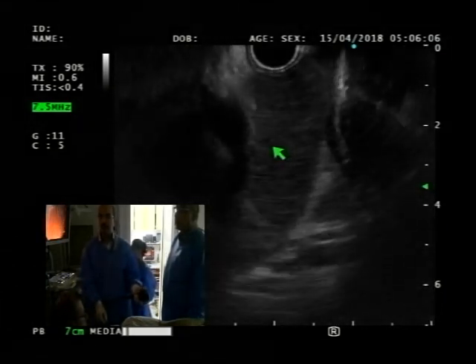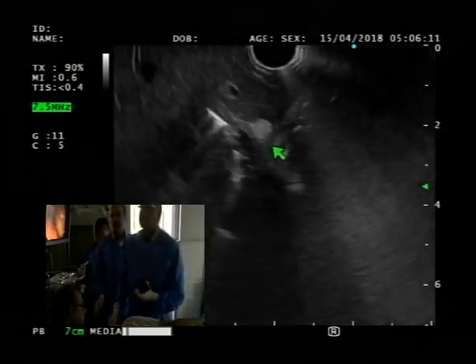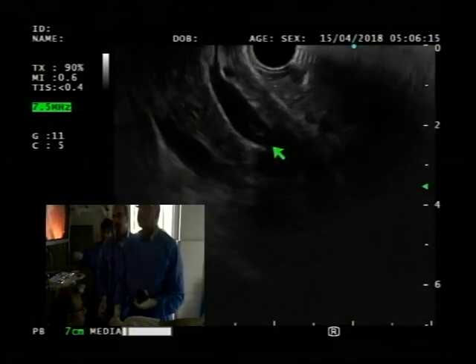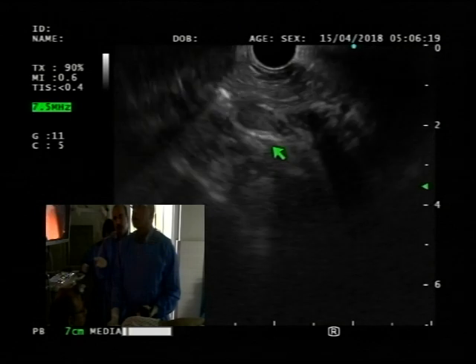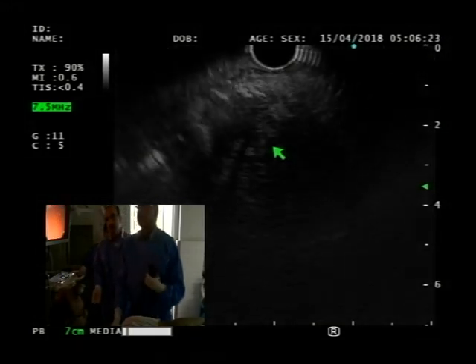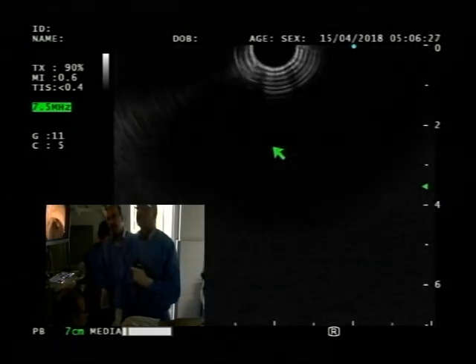Now remember, we're suspecting a pancreatic mass, so there may be duodenal altered anatomy, and then big wheel towards you, just like ERCP. Okay, this is again oblique wing. There you go. And now, excellent. Okay, there's your stent.